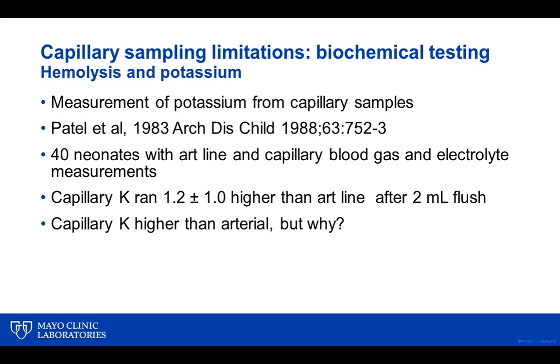What about other common biochemical measurements? I mentioned potassium is enriched in cells, and potassium is one of the most common tests we want to measure in the lab. So can you get an accurate potassium from a finger stick or heel stick capillary sample? And there'll be several slides on this, and I think the answer is maybe. It depends how much uncertainty you're willing to have in the potassium measurement.